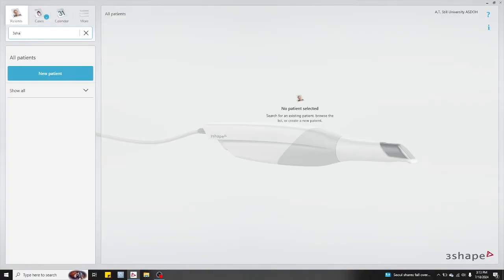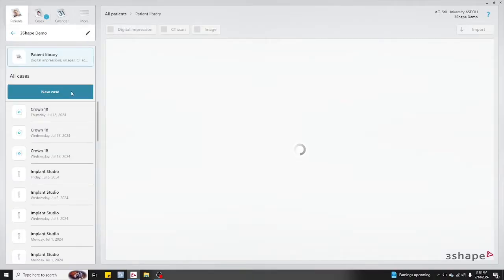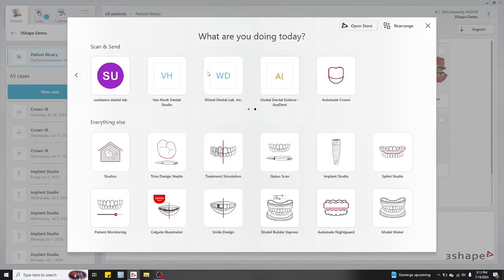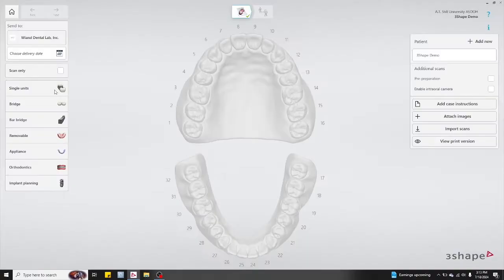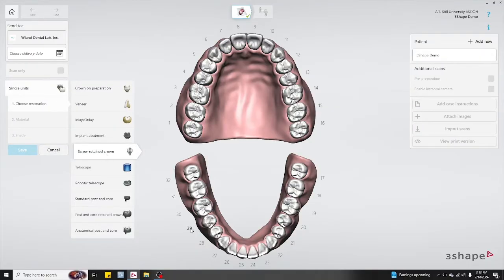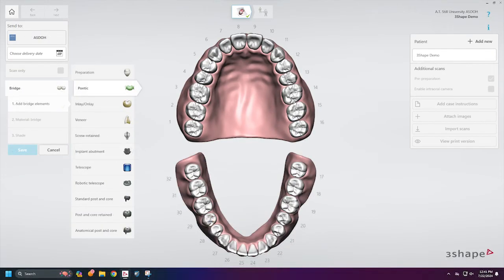Once you've launched 3Shape, go ahead and search for your patient's name, then hit new case and select the lab that you're going to use. Then set up the details for the case — click on single units or bridge depending on your particular case. You can click on screw retain crown and then select the tooth. If you're fabricating an FPD, don't forget to go back and designate which is your pontic site.